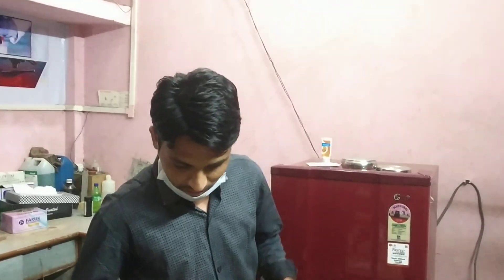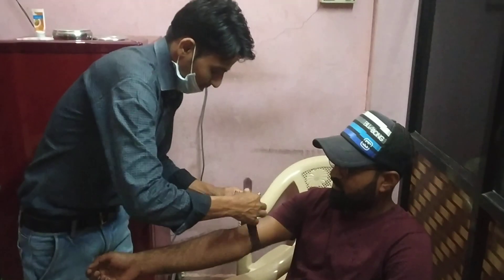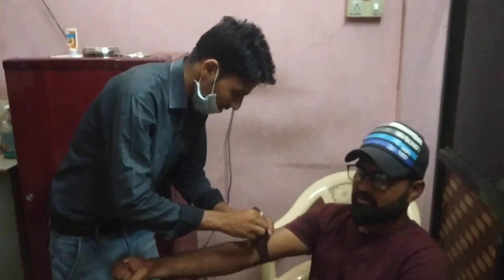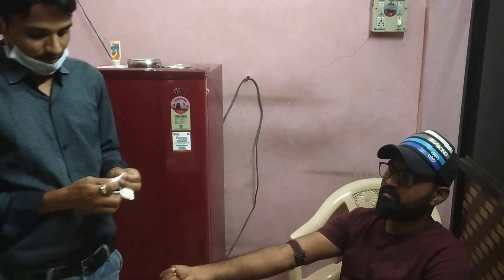It is that you can use the patient's own materials. This is a tourniquet — I will make it a little bit more secure. The spirit swab is ready.